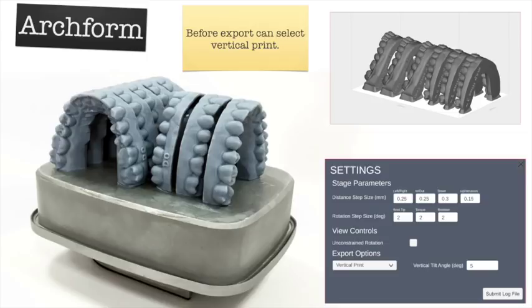Another nice thing about ArchForm is that it can orient models for vertical printing and develops a little base so you can really load up your build plate. That said, it's a matter of personal preference — I don't like printing vertically because it tends to be too much work, it takes longer, and the longer you're printing the greater the chance of print failure. So I print most of my prints horizontally with supports.